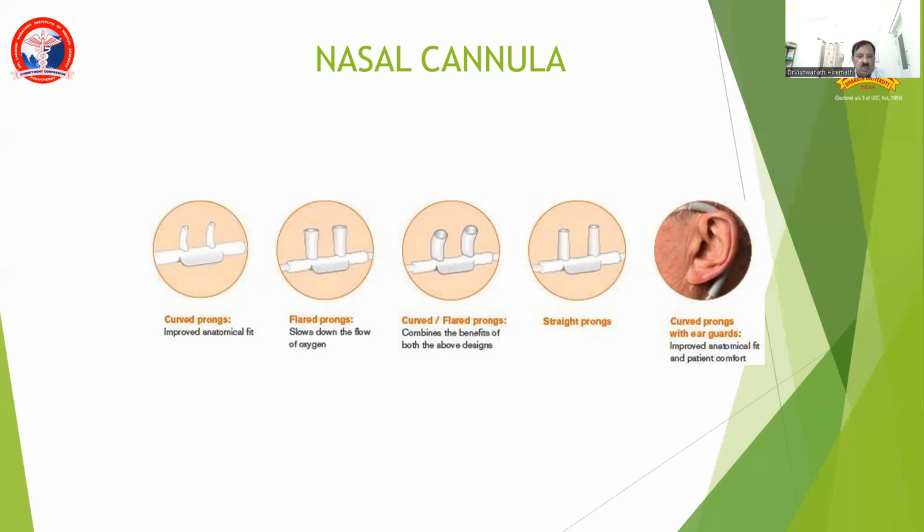Flared prongs to slow down the flow of oxygen. Curved flared prongs combine the benefit of both the curved and flared design. Then straight prongs.